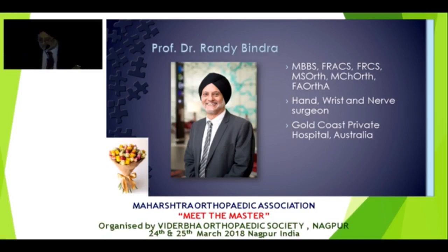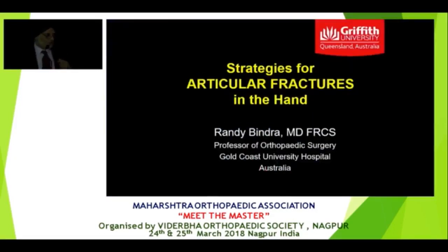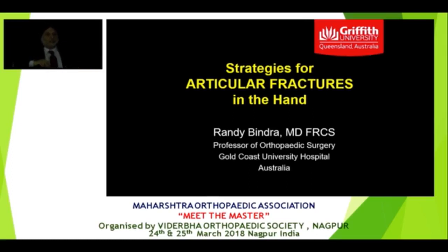While he's getting set up, these kinds of fractures, Dr. Bindra, is it important that a hand-trained orthopedic surgeon manages it, or is it possible that a regular orthopedic surgeon can do it? What's your take on this? This is exactly what I was going to come to, that these cases that I'm going to show you are probably the most difficult, challenging cases that you can have. And I wouldn't recommend doing it unless you're used to handling screws 1.5, 2 millimeter in diameter. So it does require a certain level of expertise.